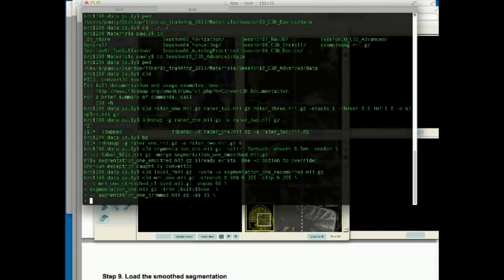Okay, we're going to now push the gray image that we had, nicely corrected for contrast and everything, back onto the stack. So what do we have now? At the bottom of the stack we have the trimmed segmentation, and on top we now loaded the big gray image. But we want the same area of the gray image as we have trimmed off the segmentation. What are we going to do for that?